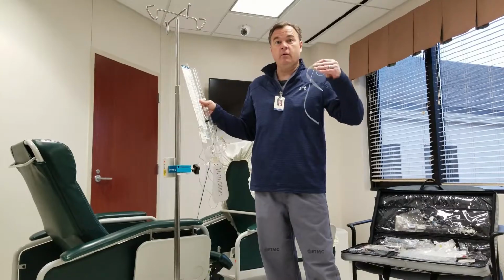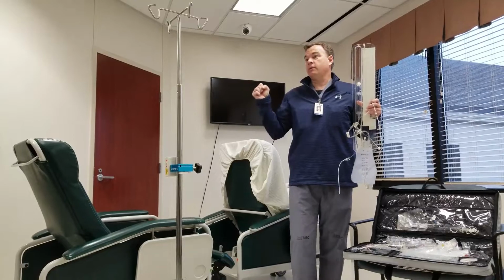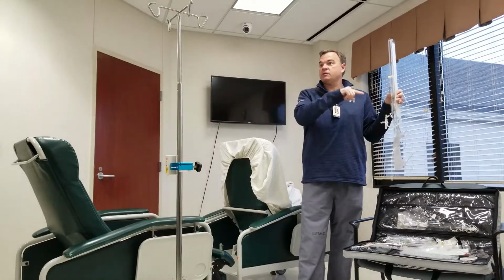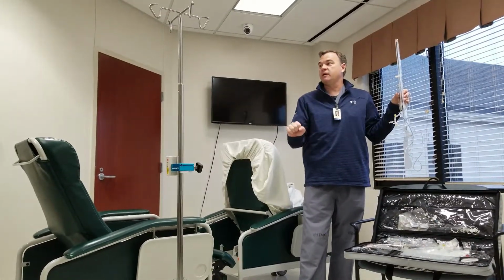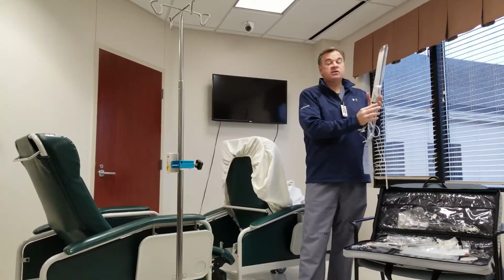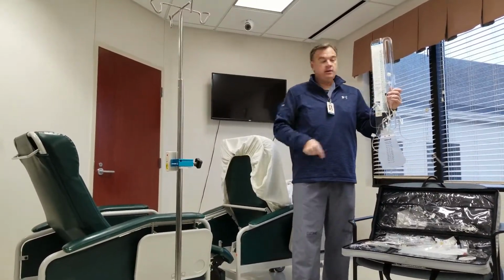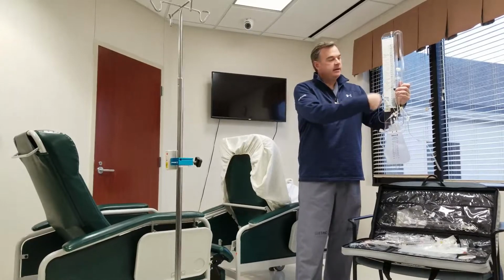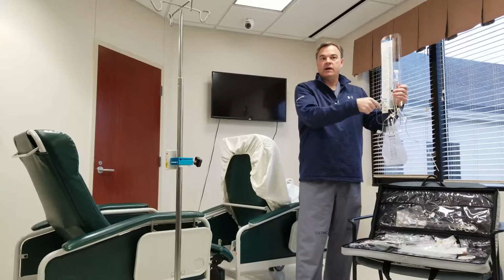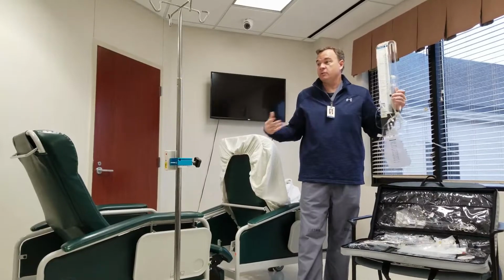Which is a little bit below. If you think about it in the true hydrodynamics, it's a sprinkler head. This valve, or this drain, opens up when a certain pressure gets to a certain level, just like a sprinkler head. You turn the hose on, the head pops up, water pushes through. Same thing with this drain, and it's just a gravity thing. So when the pressure gets to be too much, this pathway starts flowing, just like a sprinkler head popping open and relieving pressure. And that's all this is doing. That's the simplest, easiest way to think about it: it's just a pressure release valve.